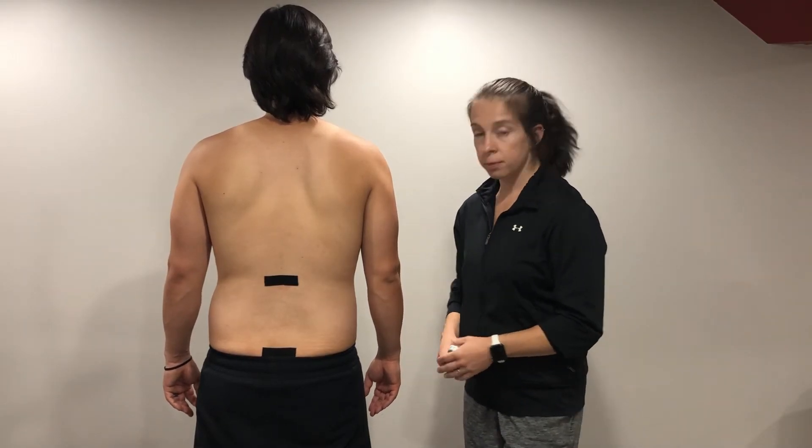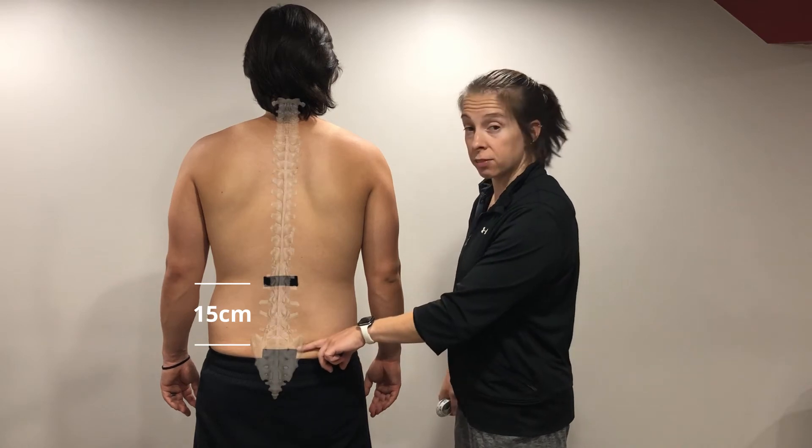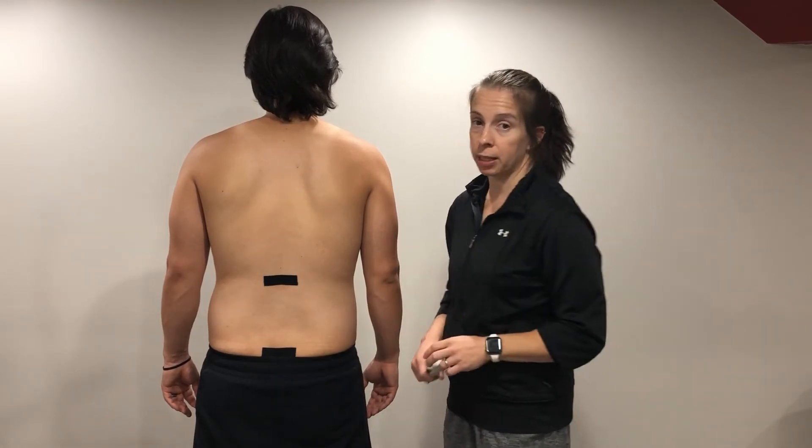Measuring extension of the lumbar spine, the patient is standing in a relaxed position. I've placed a piece of tape at the S2 level, measured 15 centimeters above, and placed another piece of tape. I found S2 by palpating the PSIS.